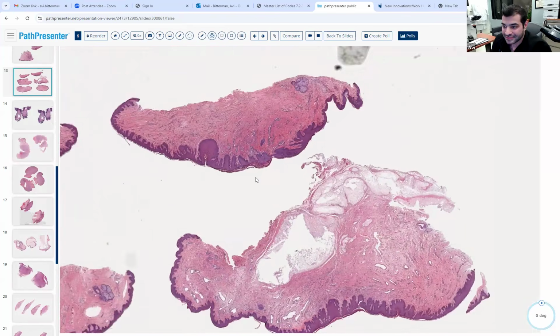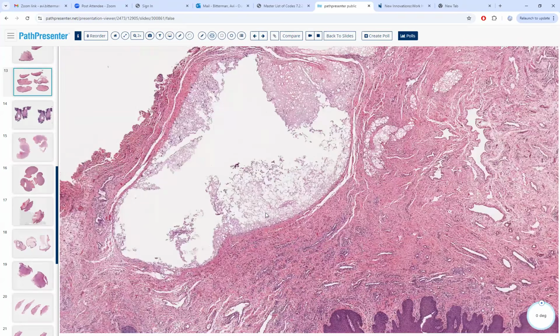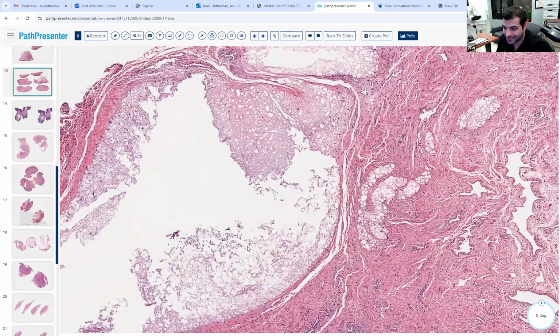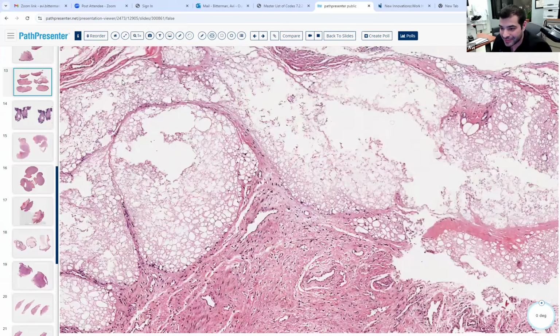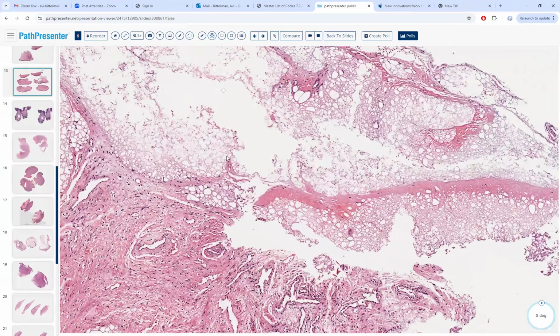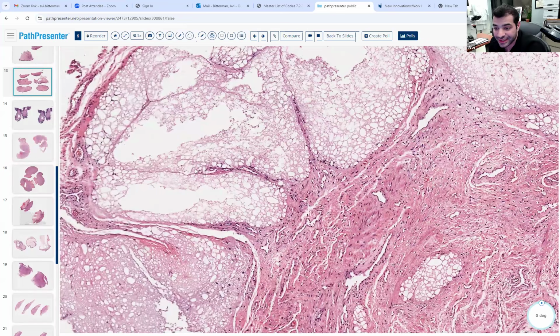Is this a suture? Well, suture wouldn't be this large or frothy like this. You would see the suture fibers. Do you see any suture fibers? No. So is it silica? Sorry, I didn't hear. Is it silica? Okay, silica is a thought.